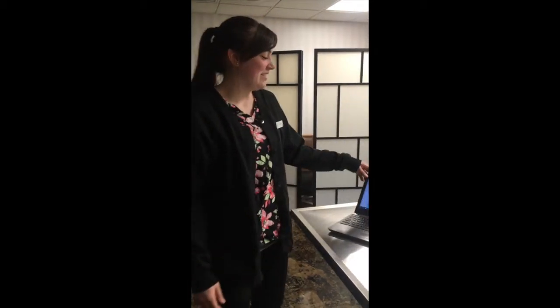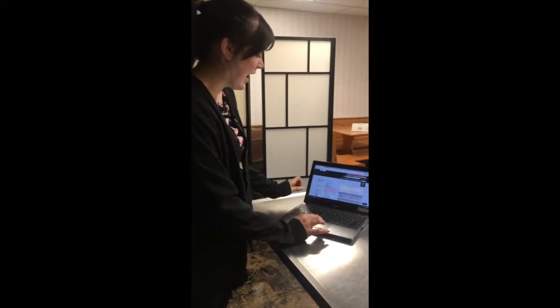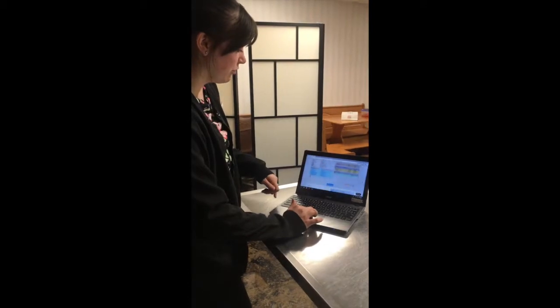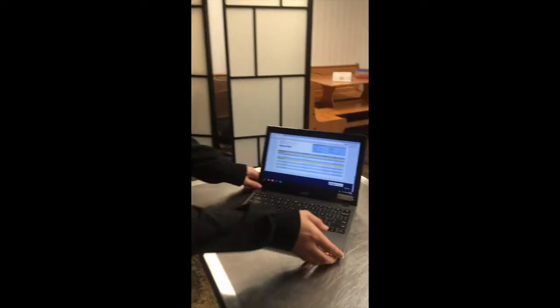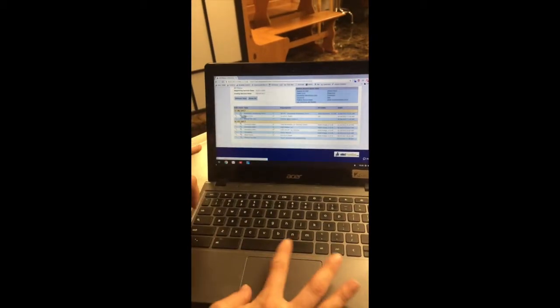Okay, I'm going to be discussing the anesthetic forms that we have for the patients. So if we come down, we have Miss Eve pulled up here. We have all of her medical records. If we scroll down to her medical record database, we have the anesthetic monitoring form. So I'm going to go ahead and open that up.